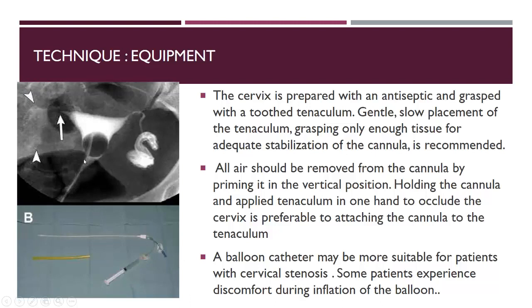This is the balloon inflated, but here I have a comment. When you inflate the balloon, at the end of examination, please deflate the balloon in order to see the cervix. You here bypassed the cervix. So if there is something cervical, you have already bypassed. So you have to deflate the balloon and try to better delineate the cervix.